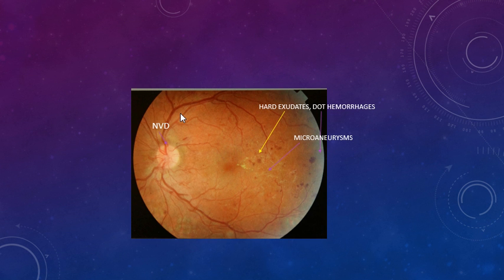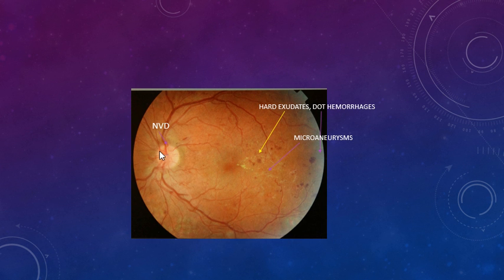This is an image of the left eye — you can see the optic disc on the left side. If you look very carefully, you can see some fine blood vessels on the optic disc; these are new vessels at the disc, known as NVD. The most common reasons for NVD are either proliferative diabetic retinopathy or retinal vein occlusions leading to new vessel formation.